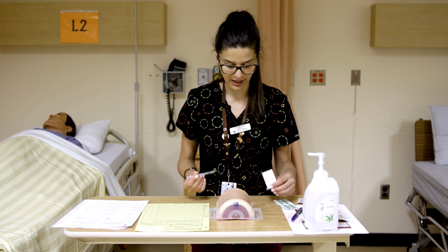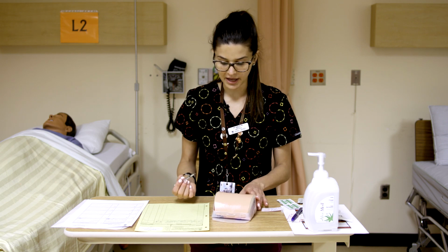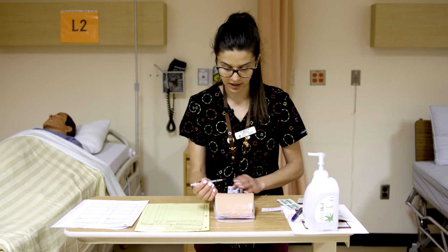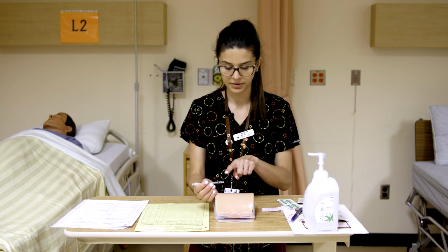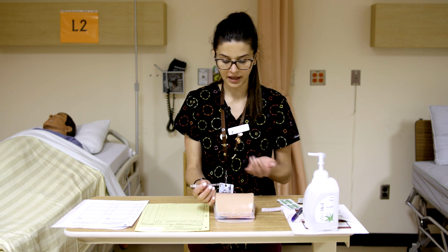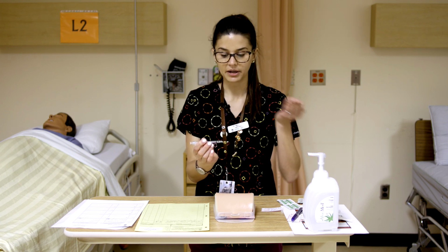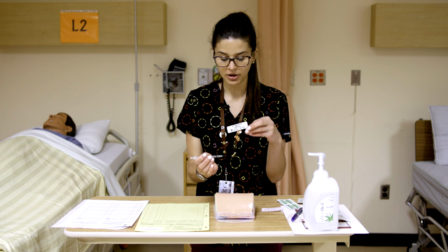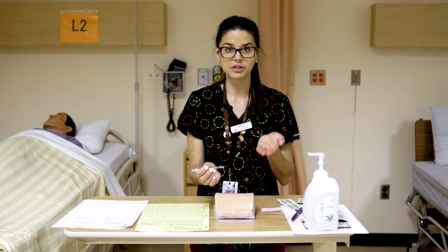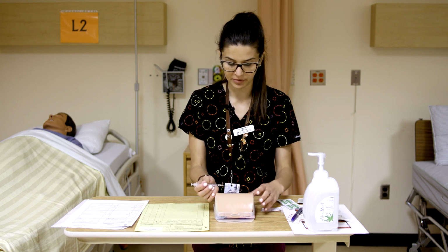So we're going to uncap our needle once we've verified it's the correct patient and they understand the procedure, and we're going to go for it here. The one thing that is really important with intradermal is that you keep that bevel up. The bevel is the slit in the needle there, so you want that slit to be up when you inject. If it's down, what can happen is the medication can be dispersed downwards instead of upwards, and we do want to see that bleb in the dermis, so we want to keep that bevel up when we inject.